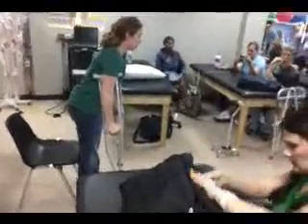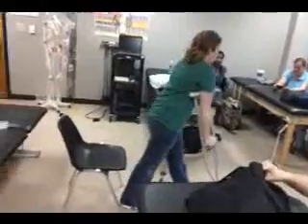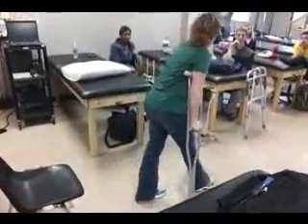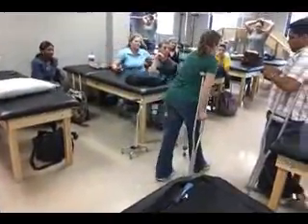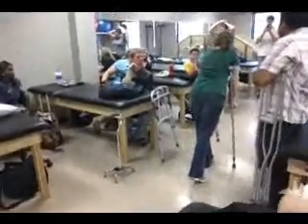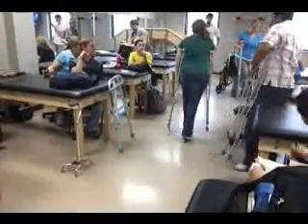So, I advance a crutch and the opposite foot, crutch and the opposite foot. What is this again? 4-point. It's my slowest, most steady with 2 assistive devices. 4-point. Opposite, opposite, opposite, opposite.